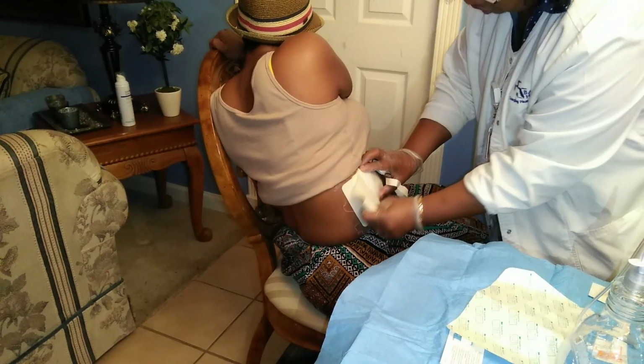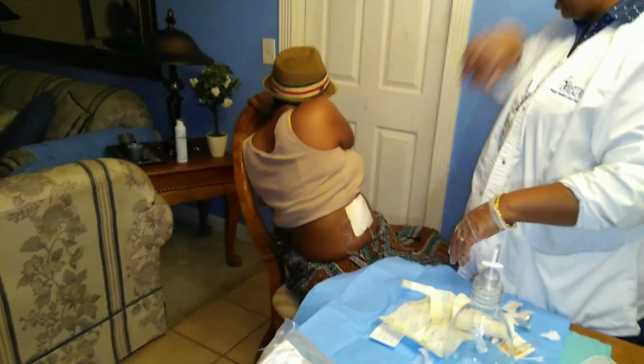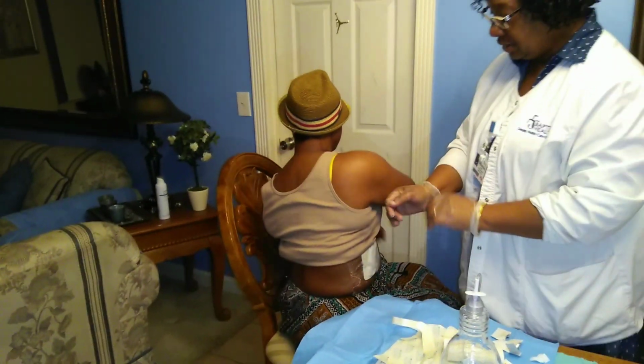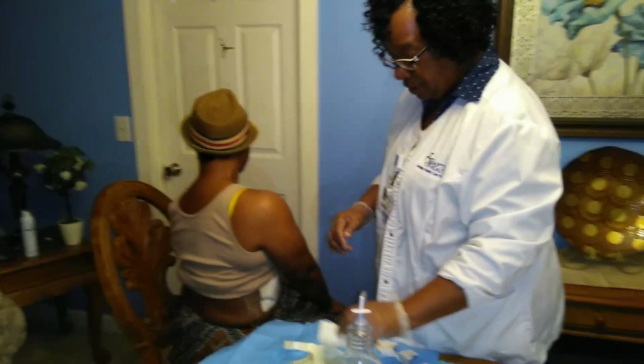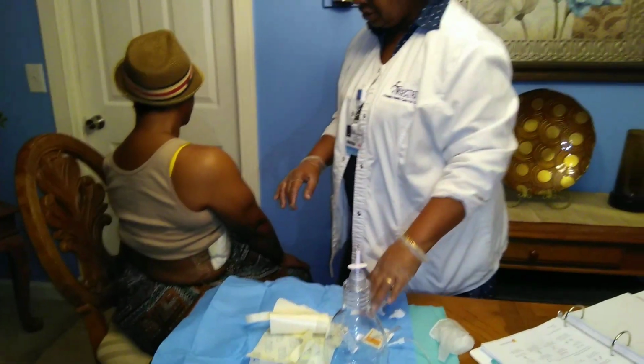So that's what you will see when you actually get to the patient's house. The dressing is completely enclosed. Once you finish completely enclosing the dressing, you're going to have the patient sit up. You're going to go ahead and listen to that patient's lung sounds again. Check that patient's O2 sat level. Make sure they're in a comfortable position, that they're safe.